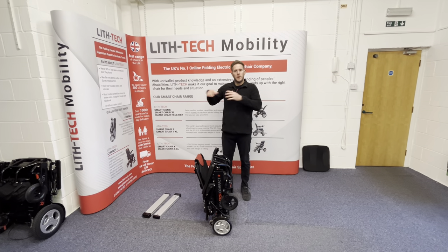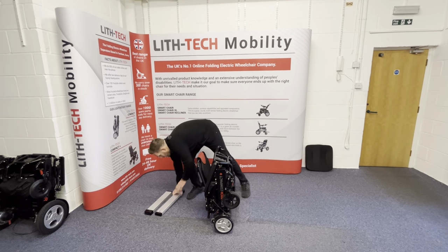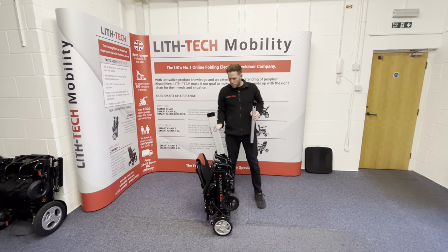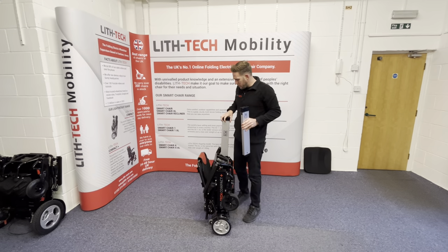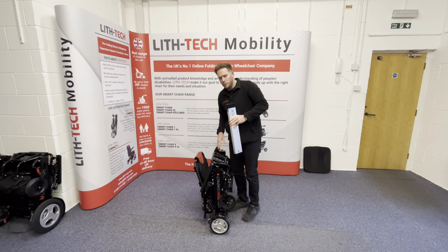You've got the best of both worlds. You remove the batteries to make it light to get in your car. You add the batteries and you've now got a heavy enough chair that when you're driving around on curbs, cambers and pavements, your chair's not moving around all over the place.